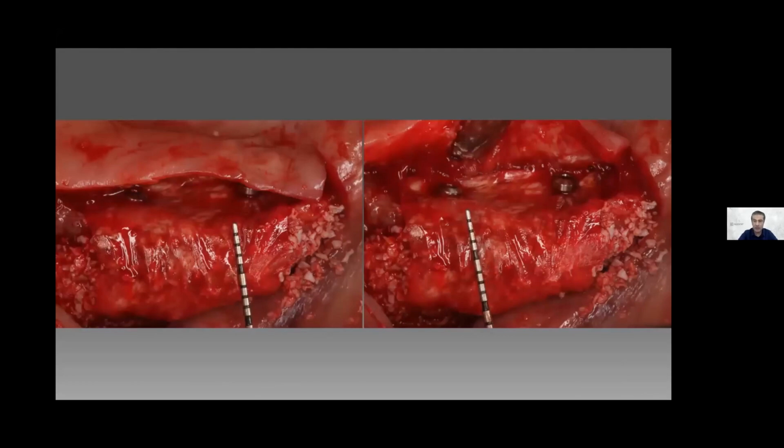some areas of 8 and some of 9. I am sure it will resorb maybe 3 millimeters. At the end we will have maybe 6 millimeters of bone. And this is very important, because all the studies now say that in the anterior zone we should have at least 2 millimeters of buccal plate. If we can have more, it will be safer. And for the posterior area, we should have at least 1.5 millimeters to have the stability of our result over time.